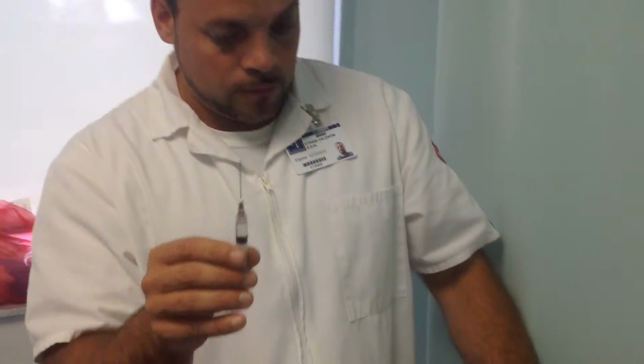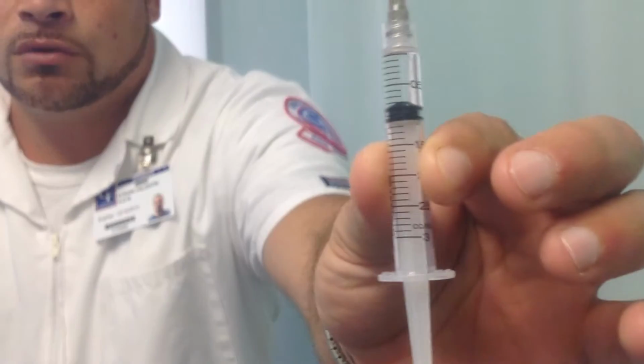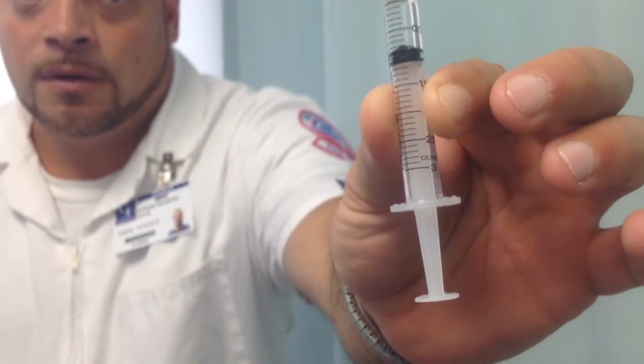Okay. We have 0.8 mLs of Vistaril. Okay, and that would give us the dose that we need.